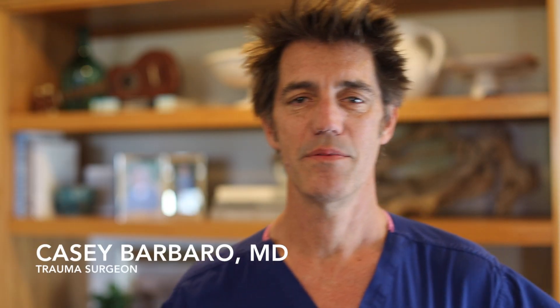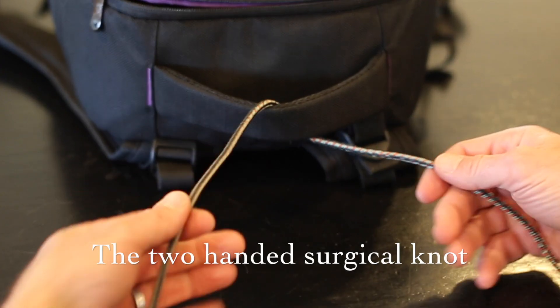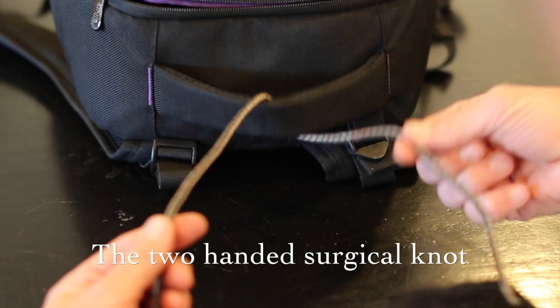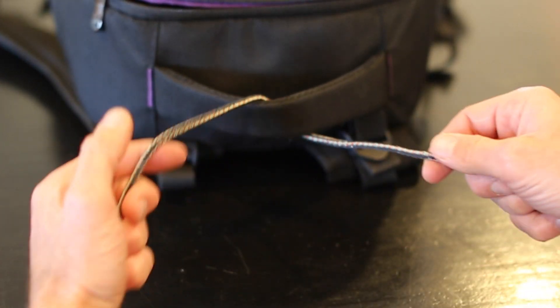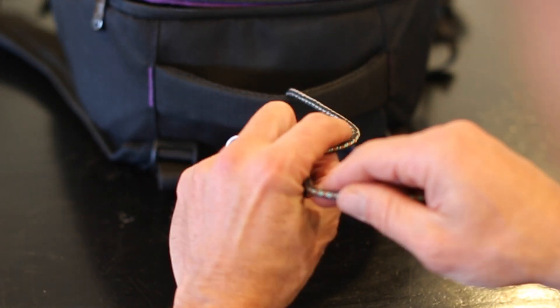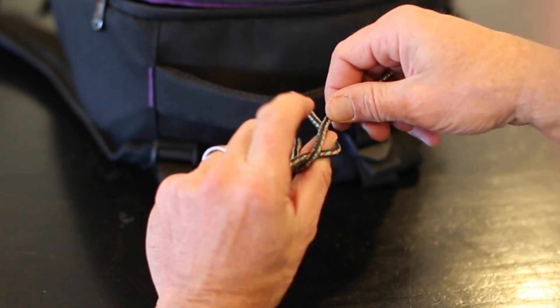My name is Dr. Casey, I'm a trauma surgeon. I'm going to show you guys how to do a two-handed knot tie. When you have two strings, the short string should be on the right and the long string on the left. You take your index finger, bring it across, and then bring your thumb up underneath and catch this string in your right hand index finger and thumb.